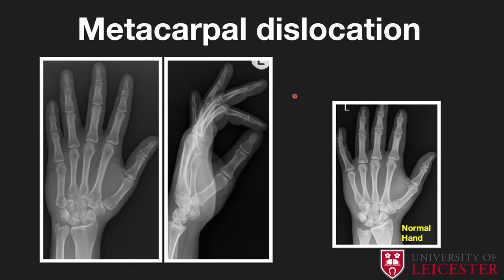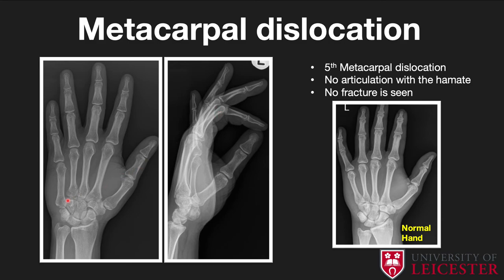Moving to the hand, an important dislocation not to miss is a fifth metacarpal dislocation. On AP and lateral projections there is significant malalignment of the fifth metacarpal. On a normal radiograph it articulates nicely with the hook of the hamate, but here it's dislocated — the fifth metacarpal has jumped forward. Interrogate both AP and lateral radiographs carefully for any incongruity. In this case there is no fracture, only a dislocation.